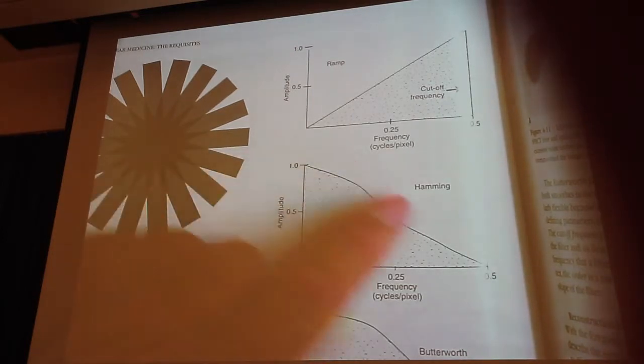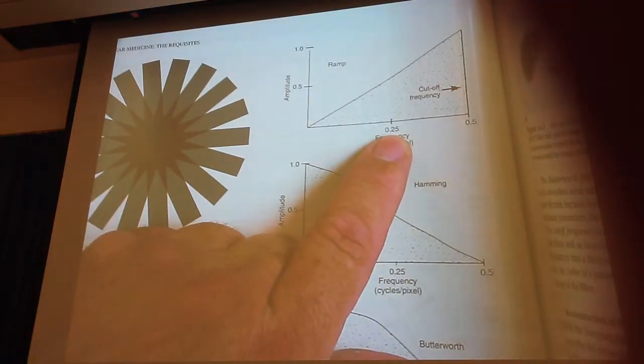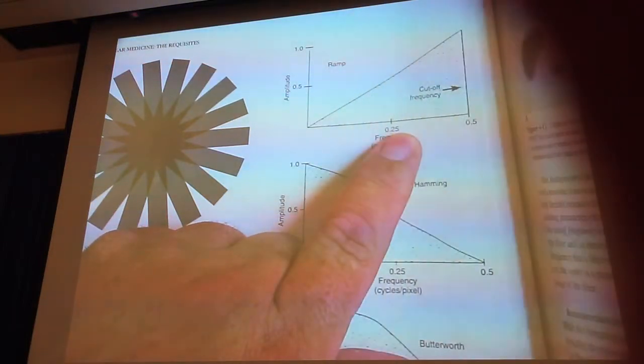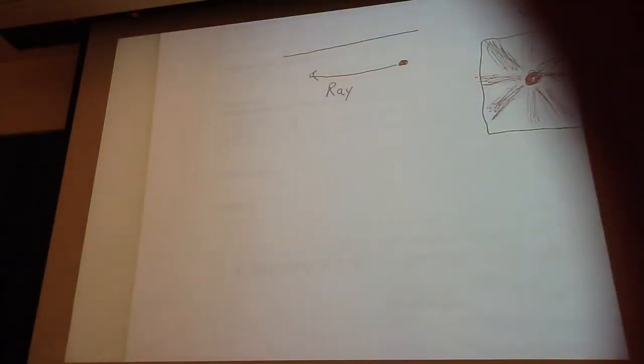So this cutoff frequency down here, have any of you ever seen that when you're doing your studies? It's like a Butterworth with a 0.25 cutoff or 0.15. What does that mean? Nobody? Well, the other number to the right of it is to adjust the noise, right? To smooth it out or make it more crisp.